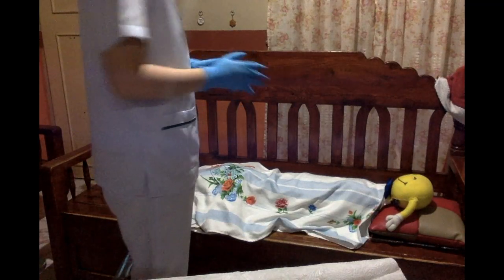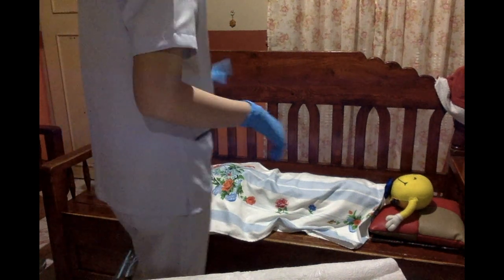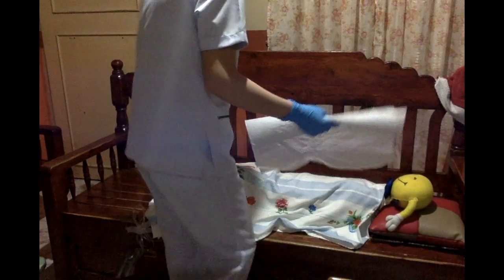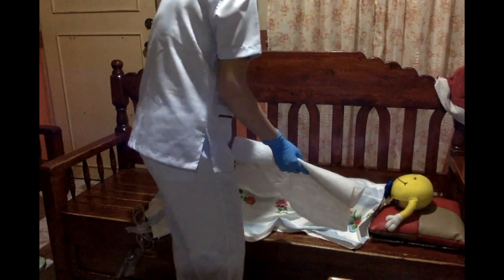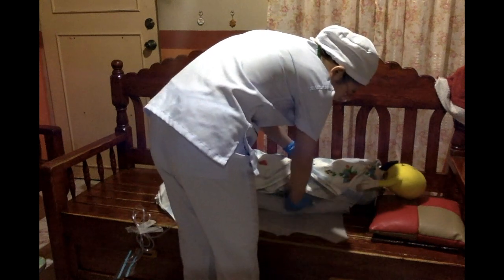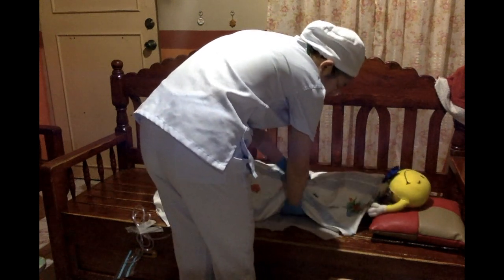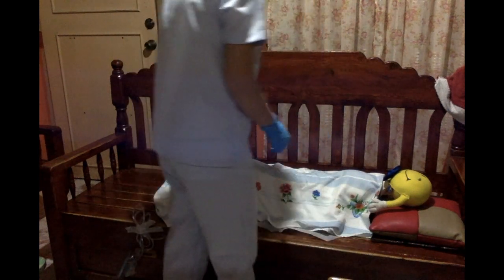I will lower the side rails and place the linen saver under the patient's buttocks. So, Miss Smiley, pakibend lang po yung kaliwang tuhod. Okay, tapos hawak lang po kayo kay nurse na nasa kabilang side. And, tagilid po. May ilalagay lang po ako para po hindi po mabasa yung inyong kama. Yung kanang tuhod naman po, yung pakibend. And hawak po kayo sa akin.